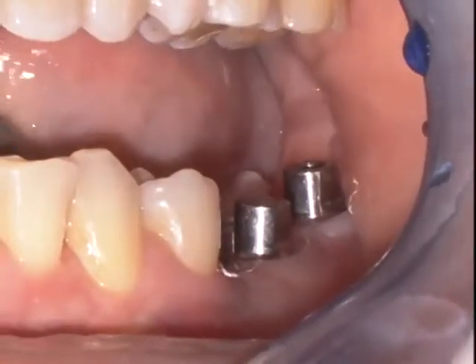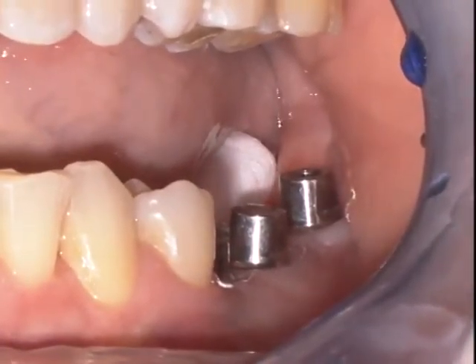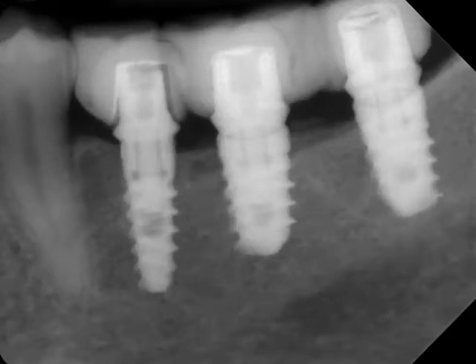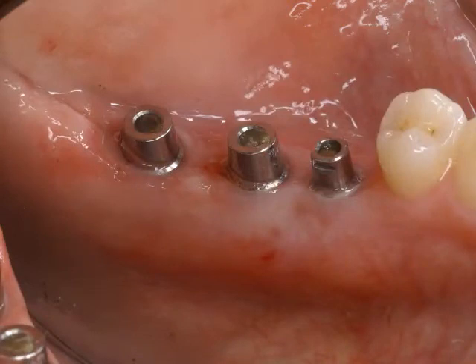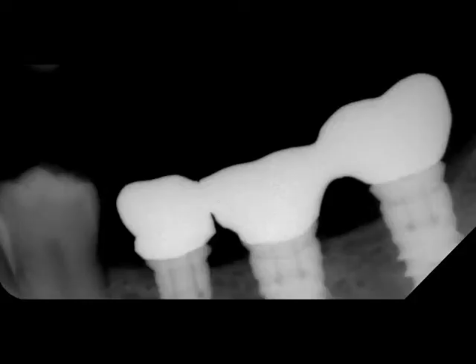This was all done in one sitting, immediate placement, immediate temporization, at the same time as bone grafting with PRGF and fibrin. You can see the preoperative PA x-ray, and then in approximately 2 months when the impressions are taken, you can see how nicely the bone has adapted because the abutments have never been removed. The bone levels and tissue levels have been maintained in a healthy form, and the abutments, again, one abutment one time, never being removed, and the accuracy of the final x-rays of the framework of the final splinted 3-unit bridge.